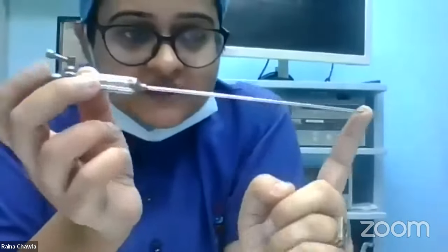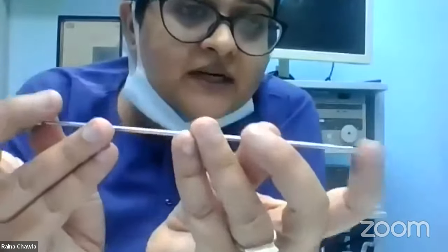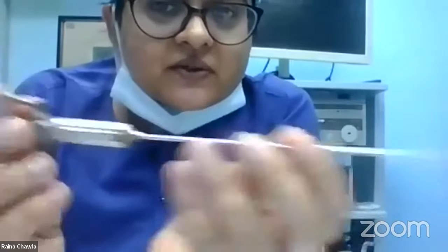The purpose of a Veress needle is to create pneumoperitoneum. What we do is we give an incision, usually an infraumbilical or a supraumbilical incision, in the abdomen. And we hold this Veress like a pen. It's basically a tubular needle, so it has a hollow structure inside. It has two ends, a blunt end here and a sharp end outside, and it has a spring action inside. It also has a valve here to allow the gas to enter.